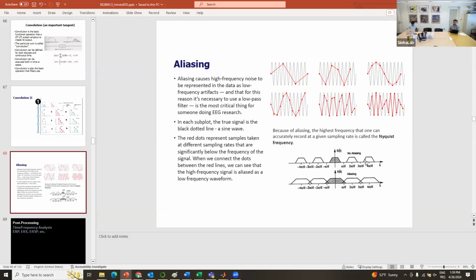And if you do downsampling, what happens is that you expand the frequency representation of these signals in every one of these axes. You can see there are replicas of it, and each one of them starts expanding. If you expand them enough, they will start overlapping with each other. If you increase the downsampling ratio, which means the period increases, you have fewer samples to represent your signal, but that causes your spectrum to expand.